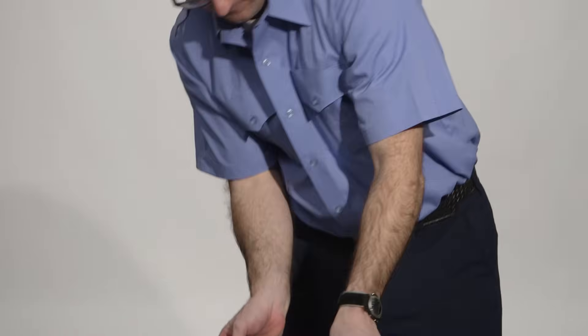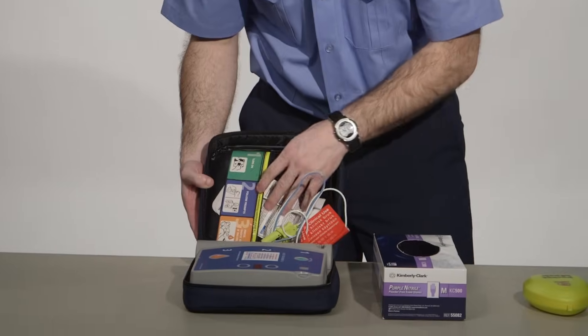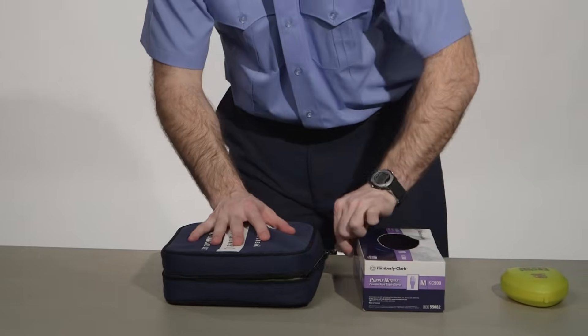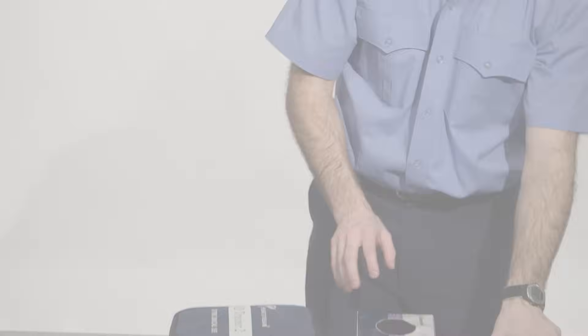You will have 10 minutes to complete this skill once we begin. I may have to clarify treatments with you during the assessment as they arise. You may take this time to familiarize yourself with the equipment before you. You arrive on scene to a neighbor's house and you find an elderly male lying on the floor. There are no bystanders present — you may begin when you're ready.